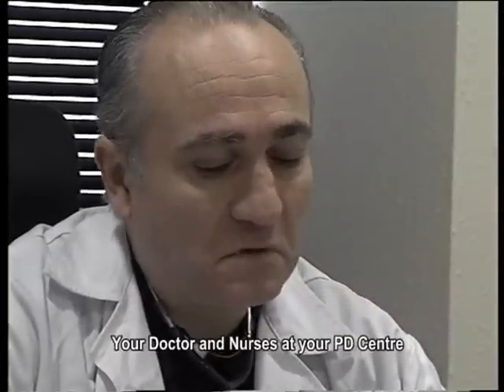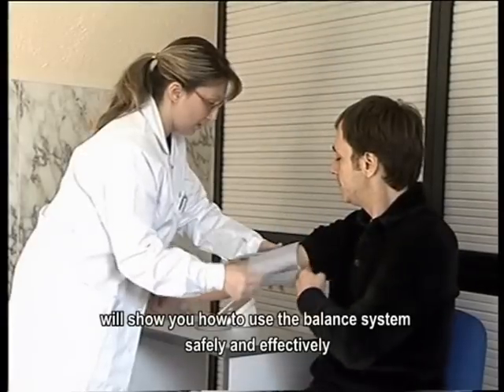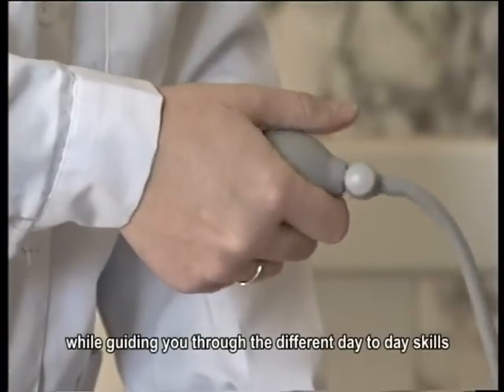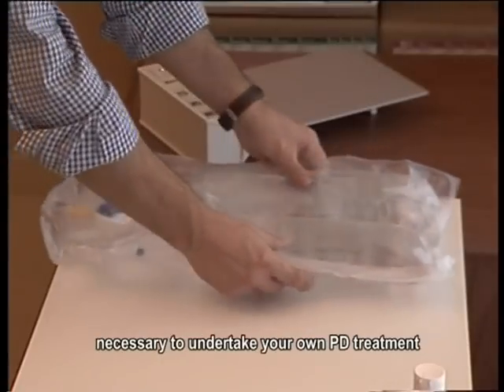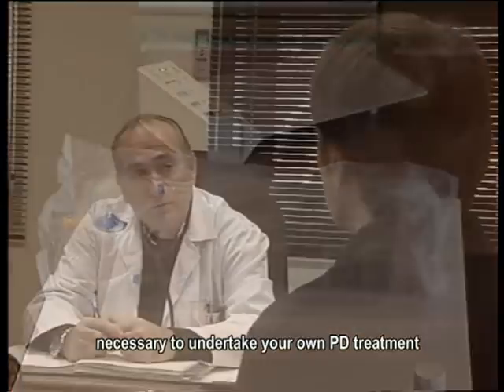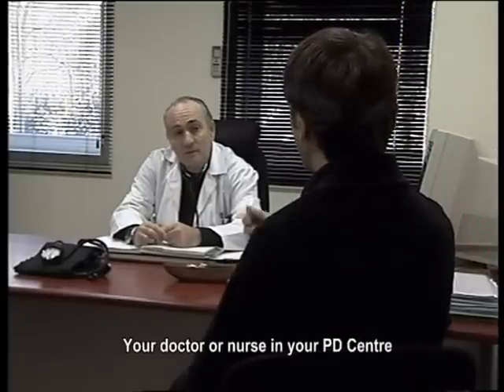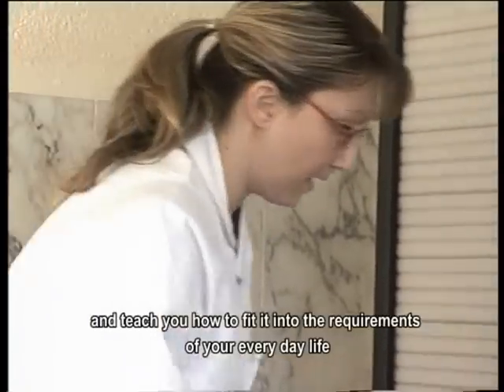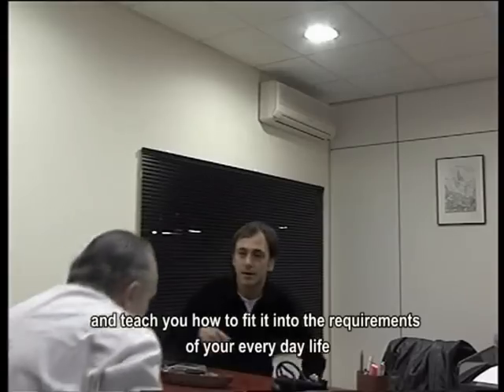Your doctor and nurses at your PD center will show you how to use the Balance system safely and effectively, while guiding you through the different day-to-day skills necessary to undertake your own PD treatment. Your doctor or nurse in your PD center will prescribe your dialysis schedule and teach you how to fit it into the requirements of your everyday life.